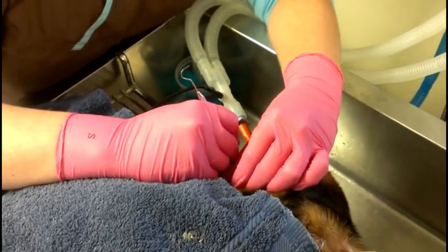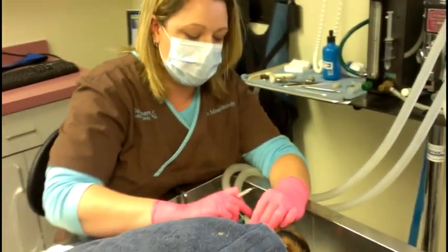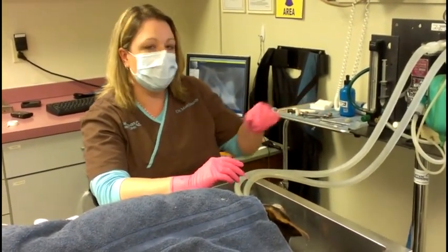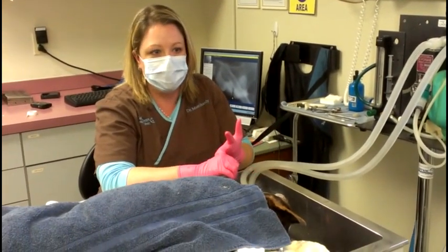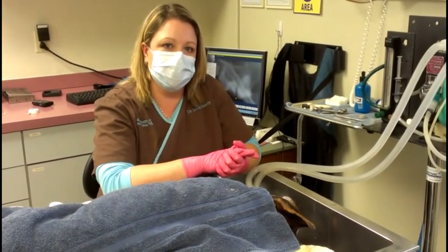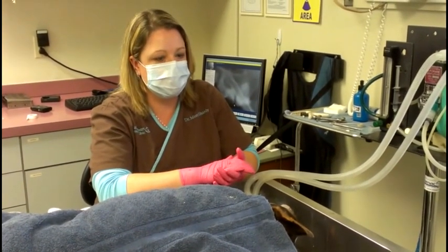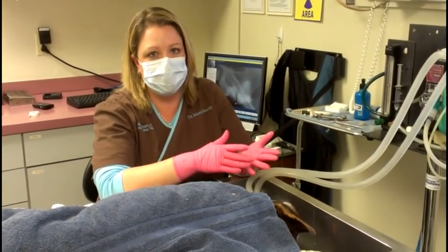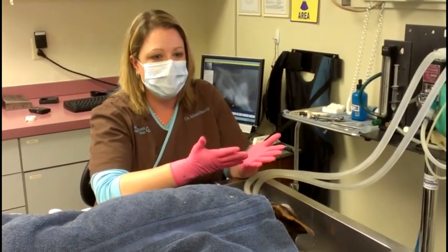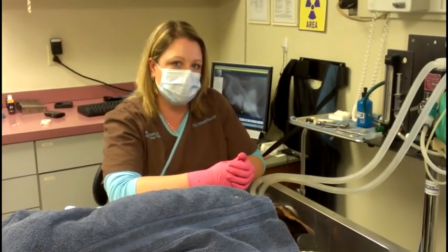So luckily for Mabel today, everything seems to be cleaning up pretty good without any extractions or anything like that. If there were issues, we would certainly go ahead and take care of any extractions. Sometimes we can put antibiotic gel up inside pockets and those types of things. I don't think she needs that today, but we do have those capabilities. There are other clinics that can do things like root canals and more extensive dental work. We just don't feel like we have the capability to do that here, but if somebody was interested in that, we could certainly get them to the right place.